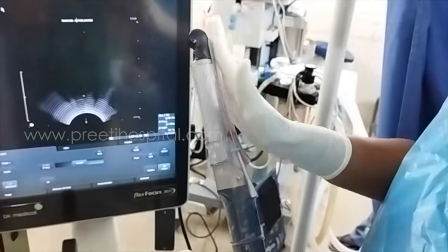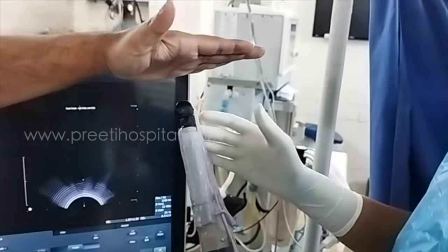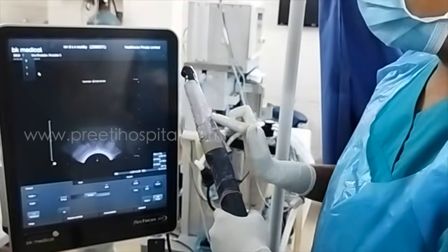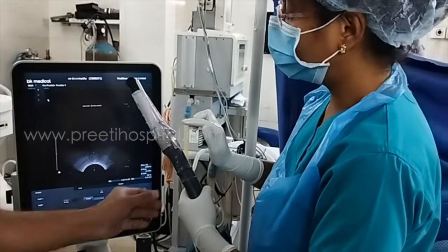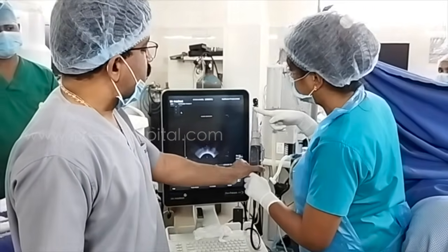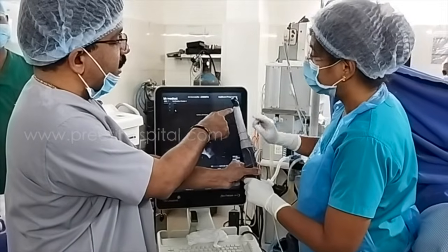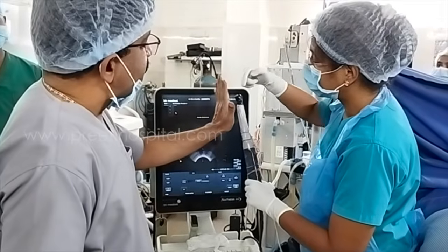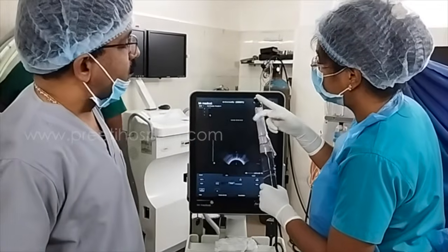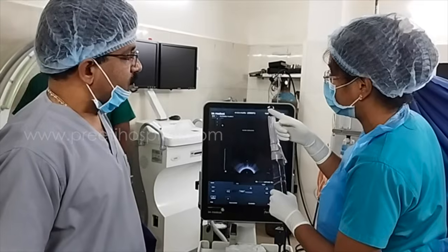And this end firing is the needle guide. If I keep it like this, it exactly end fires. Whereas there is one more needle guide which goes across this probe and exits here. That means this has a channel inside. If I keep this part like this, it fires to the side, it will not fire end. With this part of the probe we get biplanar, that is two views, both transverse and sagittal.